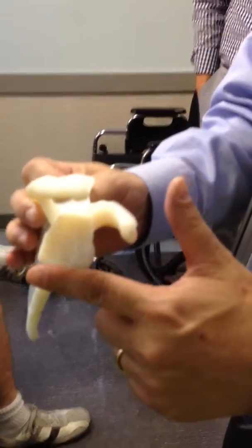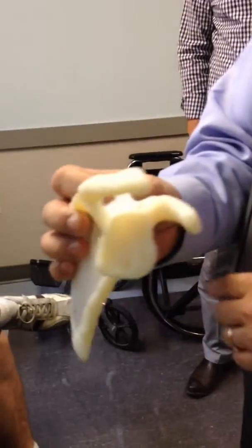What I did is I filled in this whole back with graft. This has to fill in, otherwise you're in trouble.